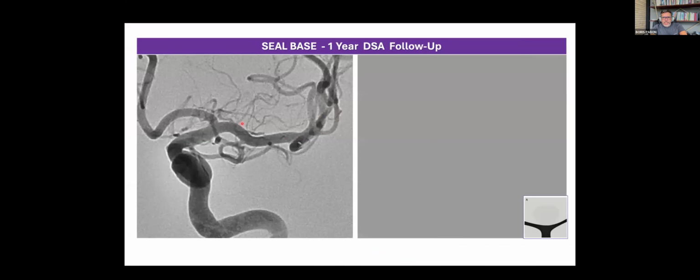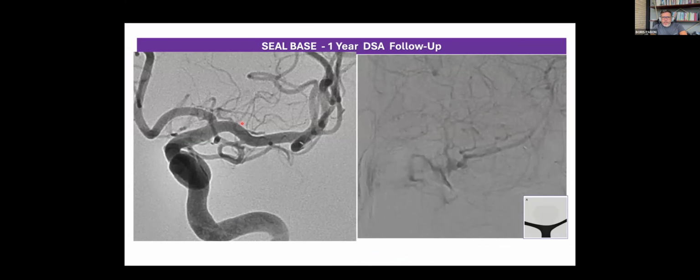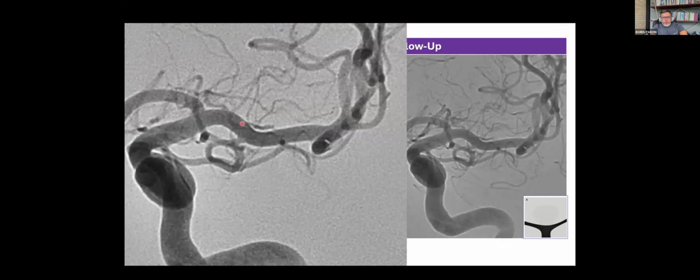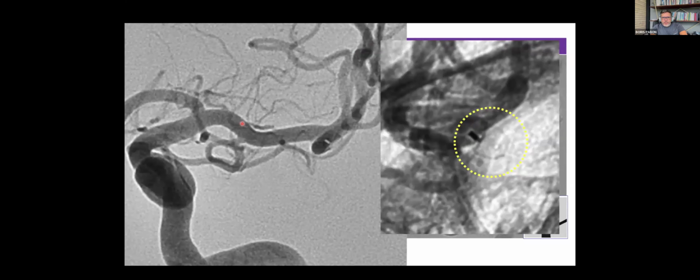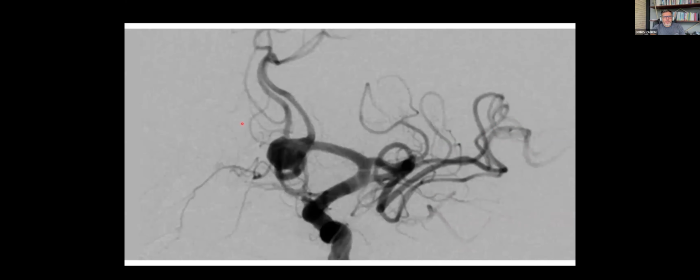This is a left MCA. You may see here the run in comparison with another intrasaccular technology, especially with the web. You can observe the proximal recess. You definitely may evidence a complete obliteration at the level of the neck. And here is a couple of very long-term follow-ups.